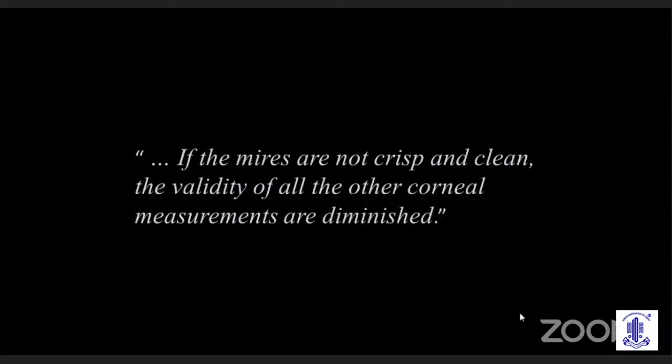If the mires are not crisp and clean, the validity of all the other corneal measurements, including your IOL power calculation, is going to be diminished.